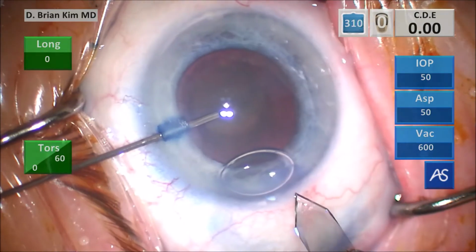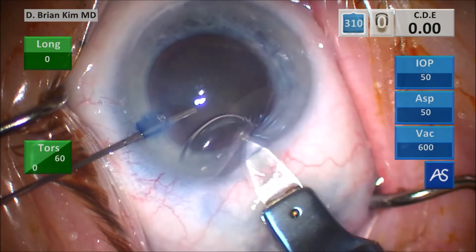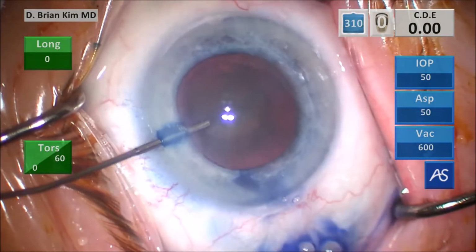This is a triplanar corneal incision. I make a vertical groove, place the blade into the deep part of the groove, tunnel through the cornea, using the cannula to control the eye, and then I enter. So this is a cool technique.